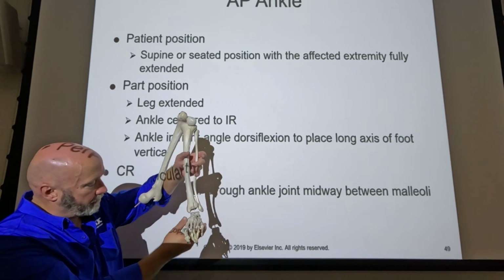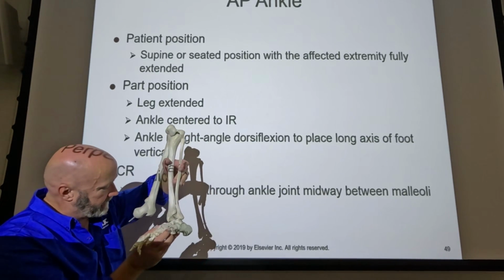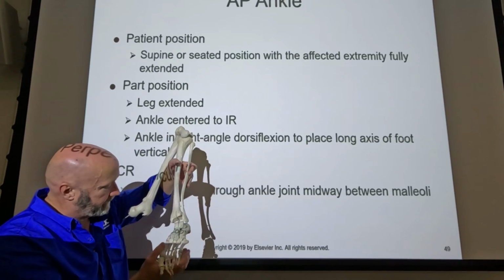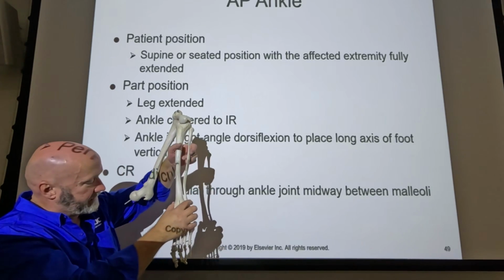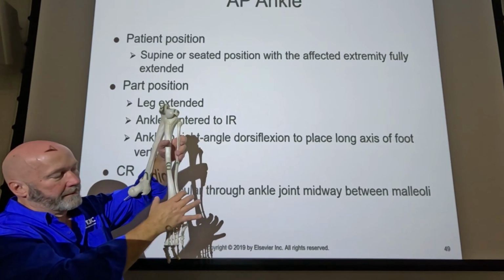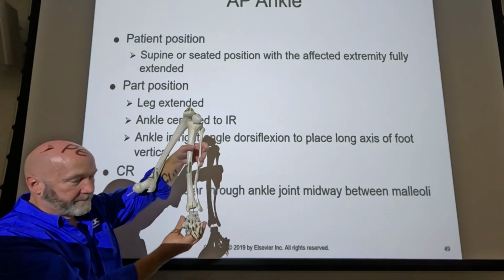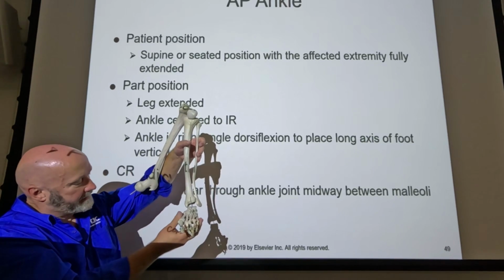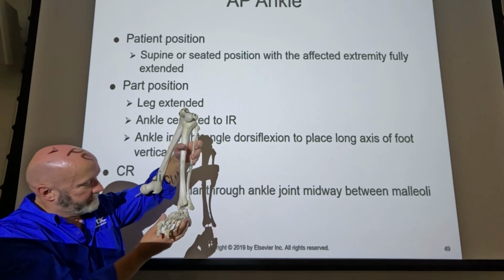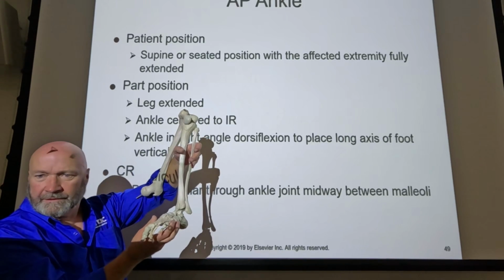And we've got two obliques. One's a 45-degree oblique, and this never really works out because we're not dealing with real human bones put together real well. But I want you to see what happens between the fibula and the tibia as I rotate this guy in. So you've got some superimposition over the distal portion, right? And as I rotate, then you can kind of see how some of it disappears, right?